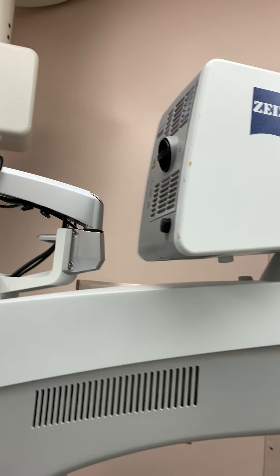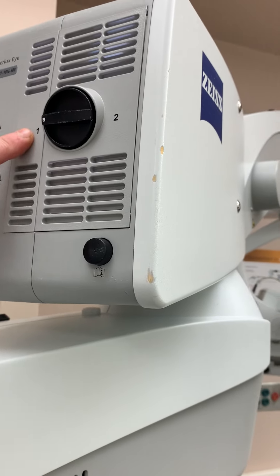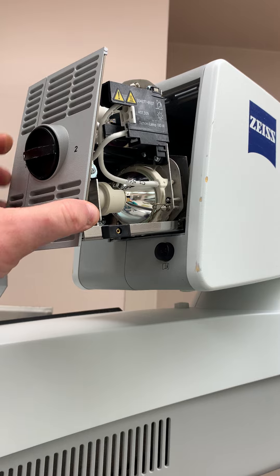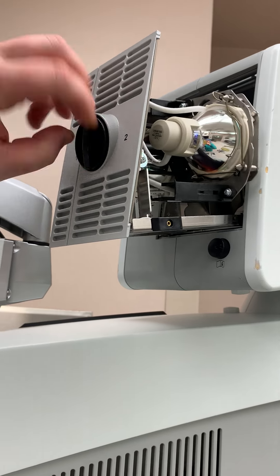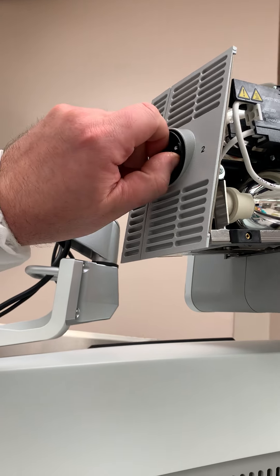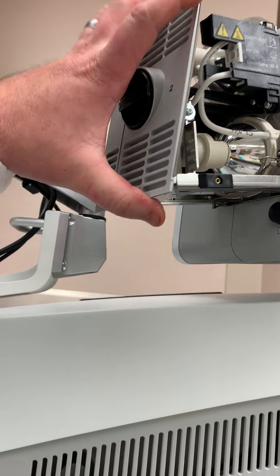You have two bulbs in here. If you see the white dot, it's showing you're on bulb one. If you pop this out, just swing this around and then push it in — that's it. It will alert you every time you start the microscope up that you do have the backup bulb in.